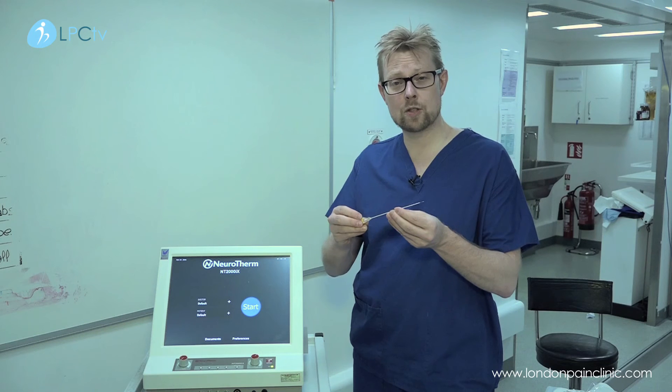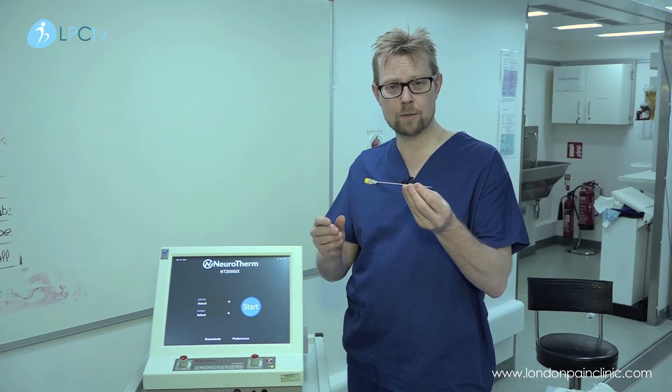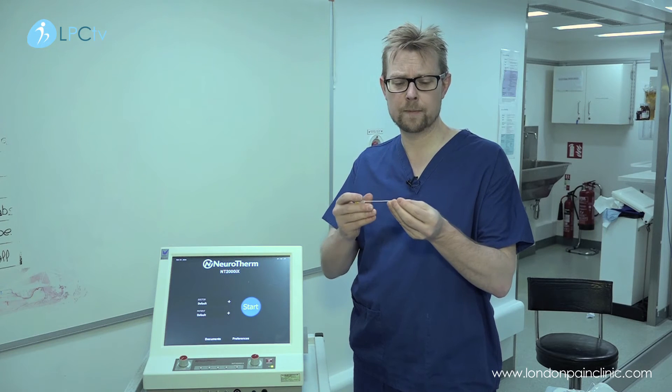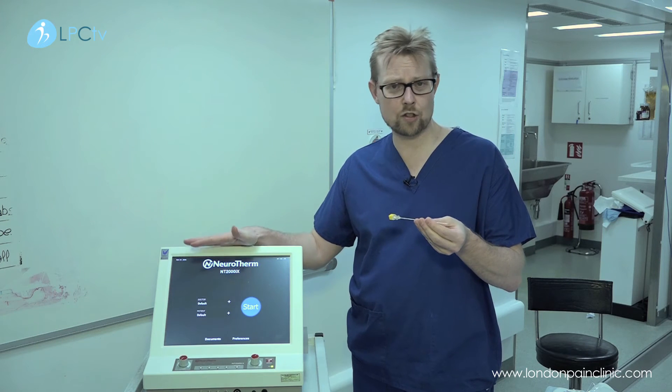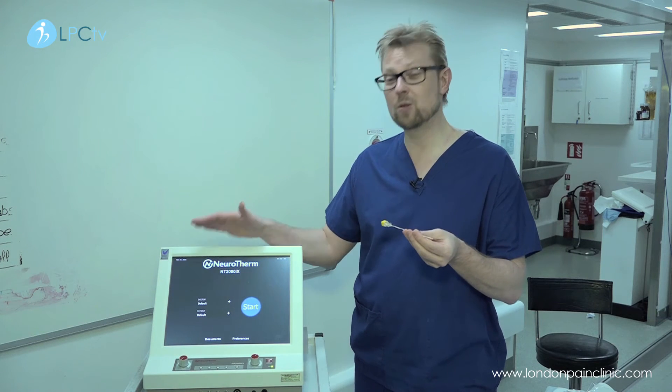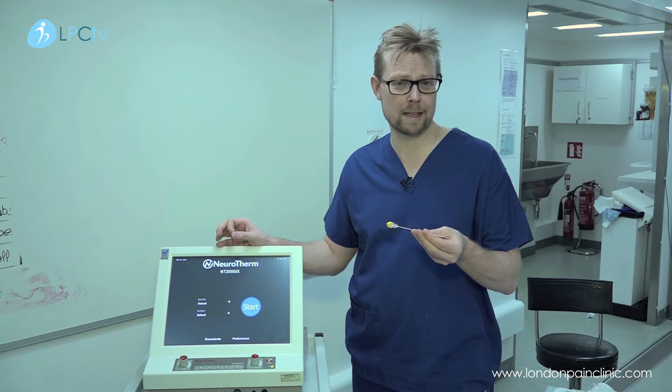We use x-ray or ultrasound guidance to get the tip of the needle down to the nerve in question. We then use the radio frequency machine to generate sensory and motor currents in order to stimulate the nerve and make sure that we're absolutely in the right place.